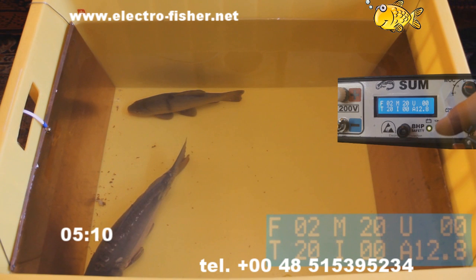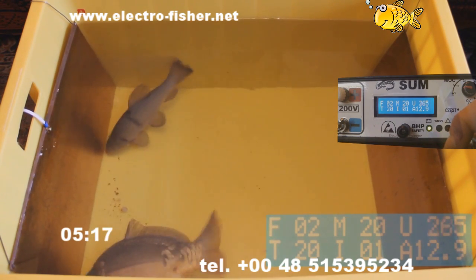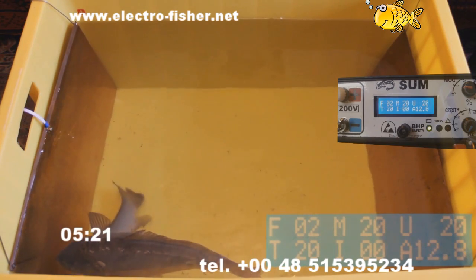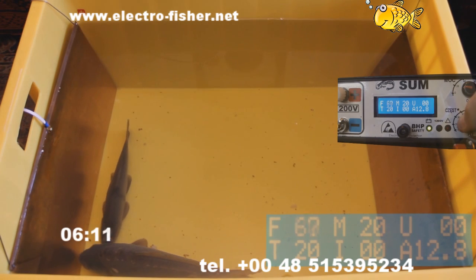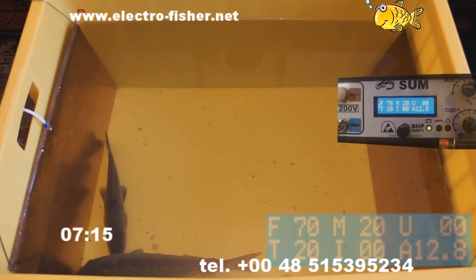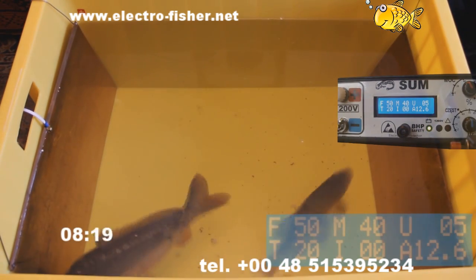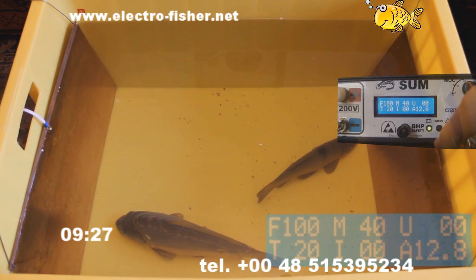And once again, for the other settings. By changing the parameters you can change the time of fish anaesthesia. And again.